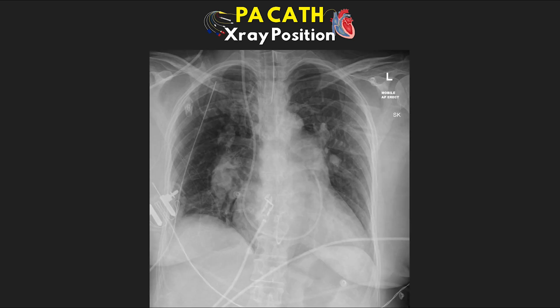For example three, following our PA catheter along, we can see it's again inserted right IJ, going through the right atrium, through the right ventricle, but this time the tip of the SWAN is just in the pulmonary artery. We can tell that in relation to that left main stem. While this isn't necessarily a bad position, it isn't giving us a true zone 3 representation of our left atrial pressure, and this one is also at higher risk to get pulled back into the right ventricle.